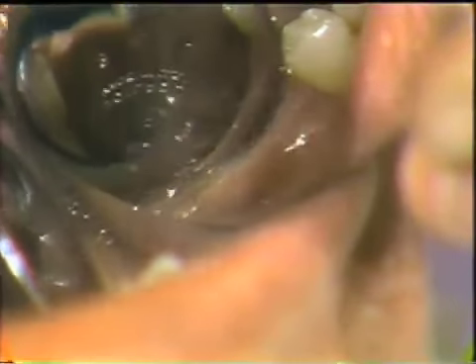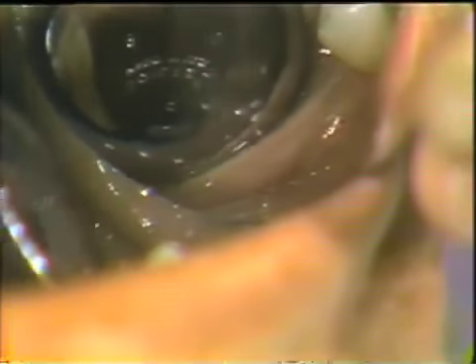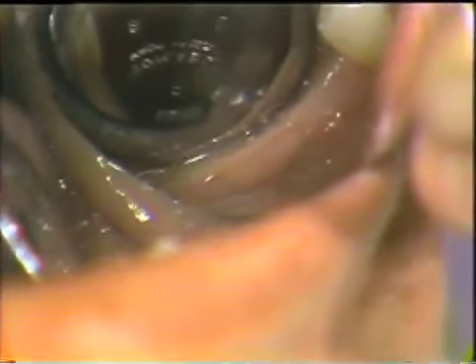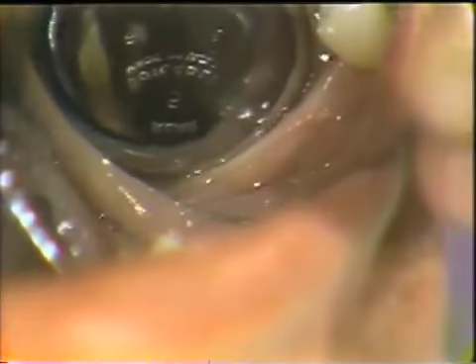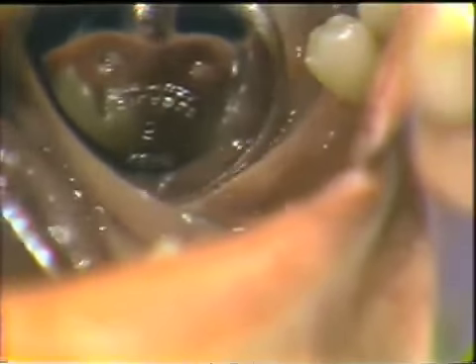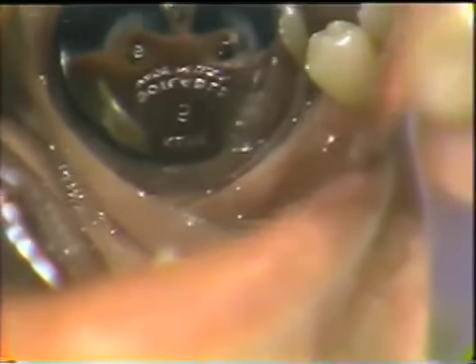I'm pressing with the mirror. Some ridges are extremely flabby or loose with fibrous tissue covering, and the residual ridge may have very little bony support. This appears to be, although fairly flat, it does appear to have a firm base for a potential saddle area.